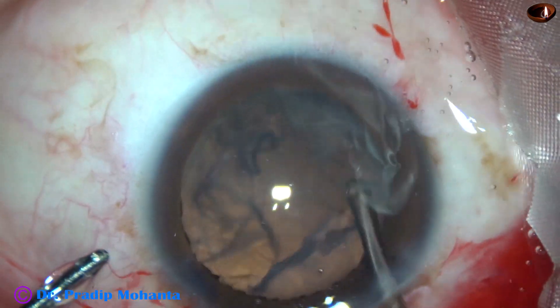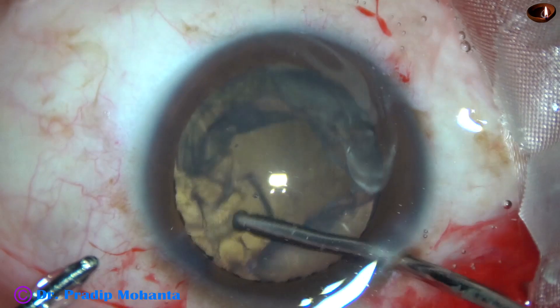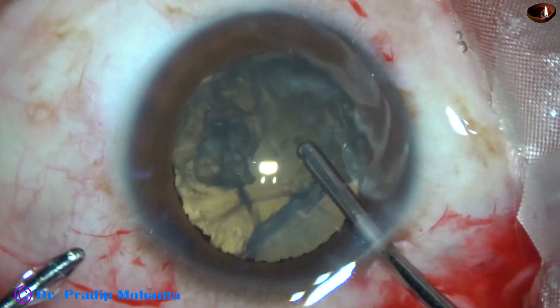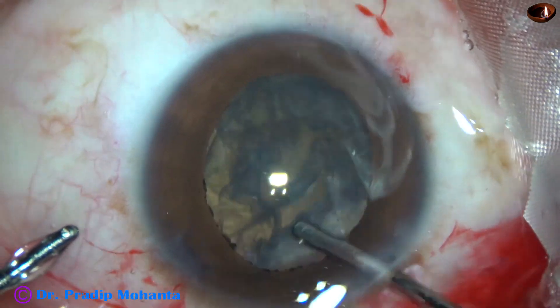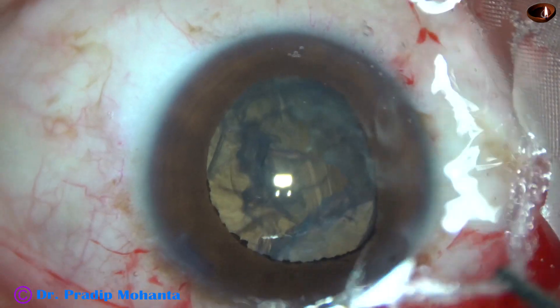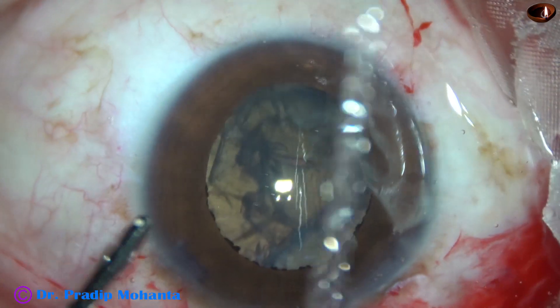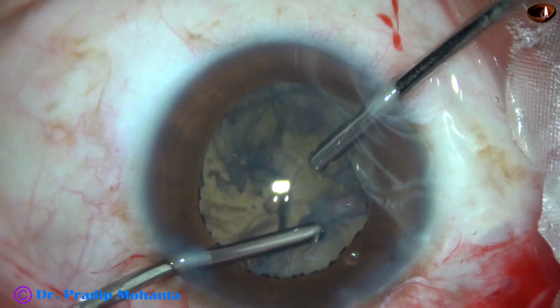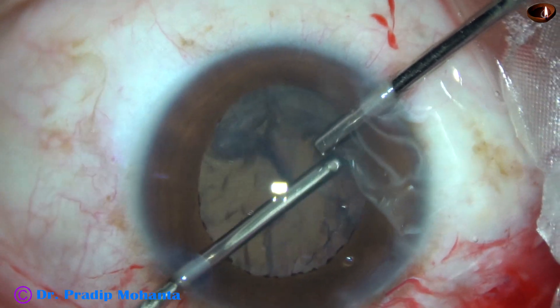So we are trying to do our best for this patient, but because of retinal detachment I could not do a proper biometry for this eye, and the other eye is also having retinal detachment. So I have kept this eye aphakic.